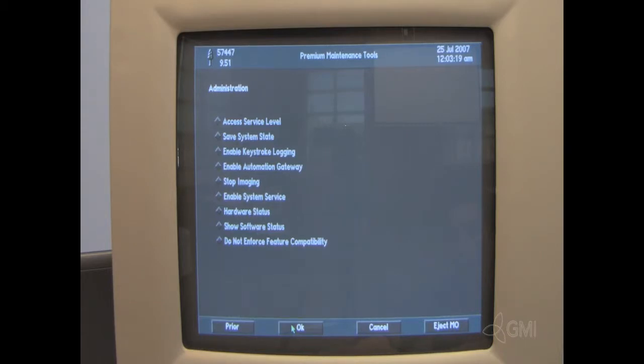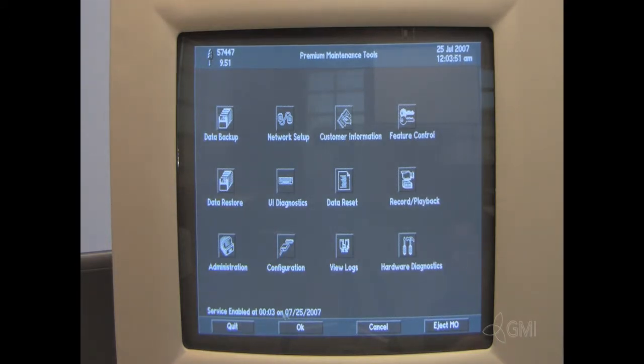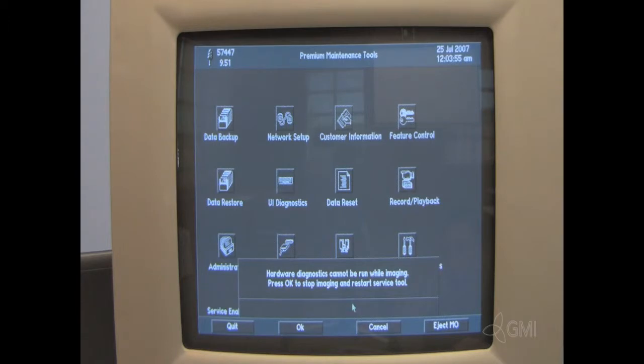Select OK. Then select Enable System Service. Select OK again, and you'll receive a message, Begin 4-hour system service enable. Select OK. Select Prior, then select Hardware Diagnostics. Select OK. The system will then reboot.